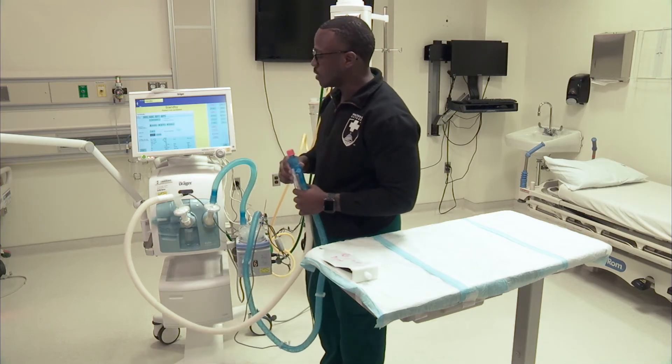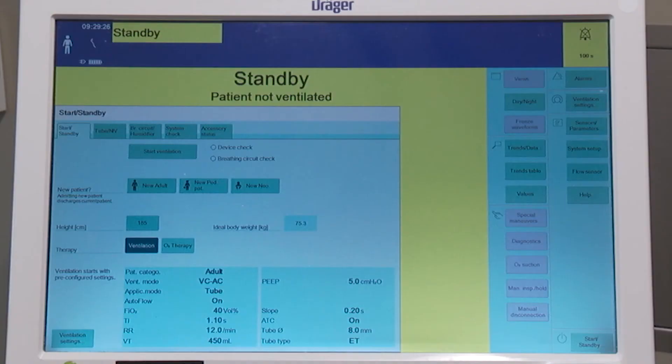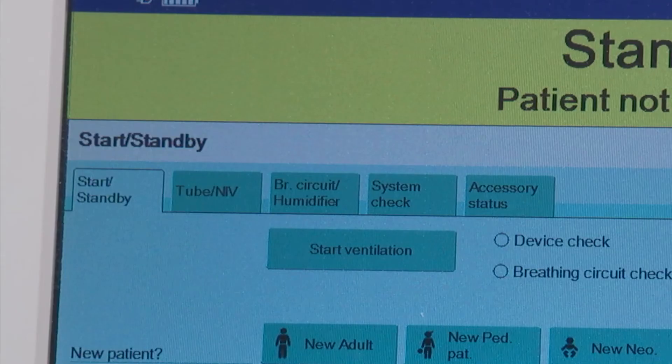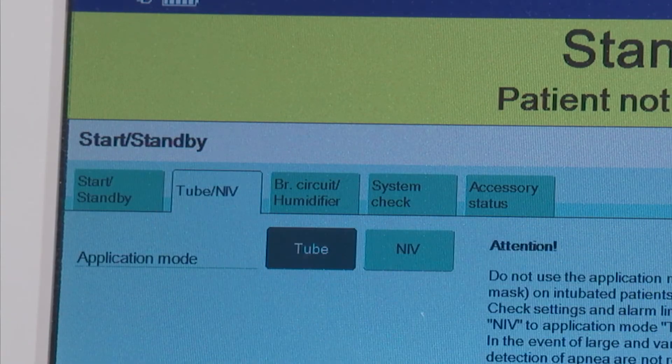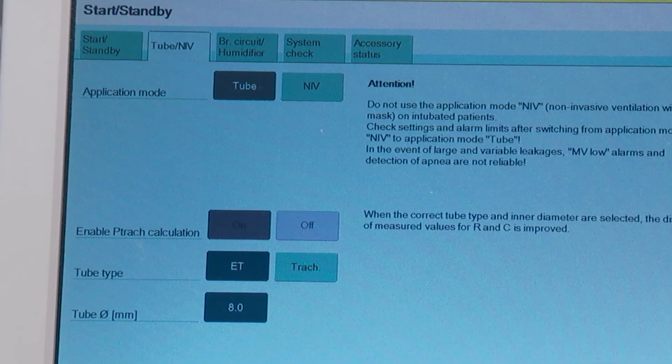On this standby tab, the first thing we're going to do is ensure that we're setting the ventilator to the tube that the patient has. So we're going to go to tube and IV. Application mode should be tube. When you look at the bottom of the screen, you have tube type and then tube size. I'm just going to ensure that it says endotracheal tube and then the size of the tube. Our patient for today's lab has an 8.0 millimeter endotracheal tube.